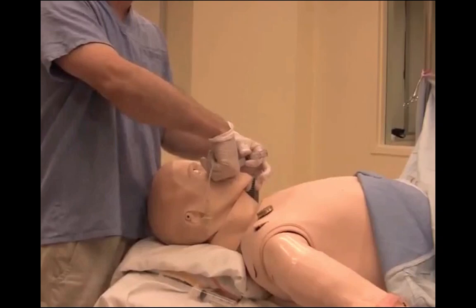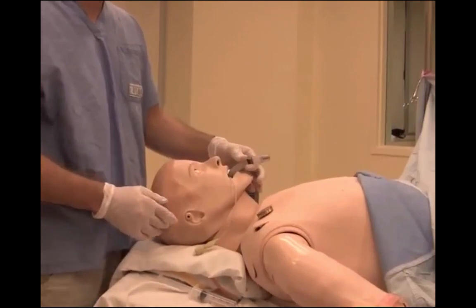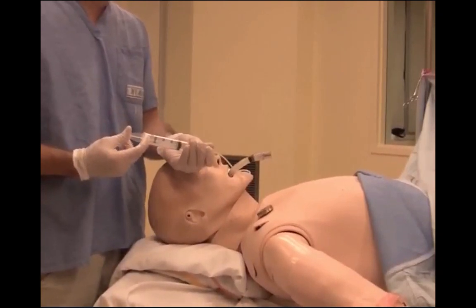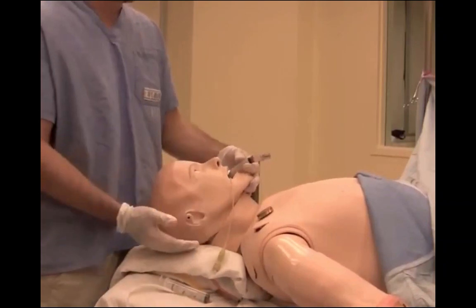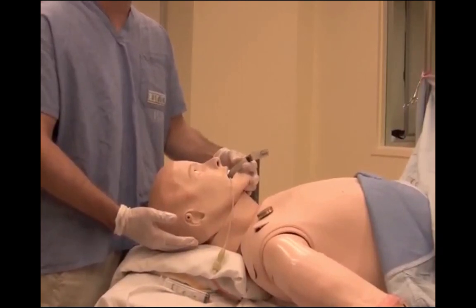You then hold the LMA with your left hand, pull out your right hand, and advance it until it stops. From here, you would instill anywhere from 15 to 20 cc's of air, and you may see the LMA come out very slightly. From here, you can confirm your placement with end-tidal CO2.